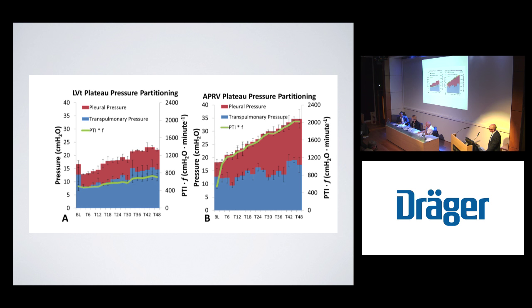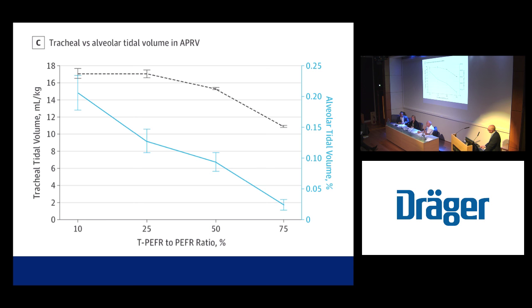The settings are even more important, and the device you use might be more important in those small babies. Real quickly, I just wanted to make one thing clear. The time that Dr. Camporota showed is for adults, that 4 to 6 second range. For pediatrics, it's somewhere in the 2 to 3 second range, and neonates 1 to 2. That's the big difference: the calculation of achieving at least a 90% CPAP cycle time at the P high, T high. I think that's very important, not only for recruitment, but for the diffusive gas exchange.